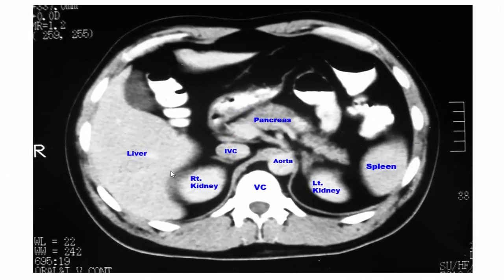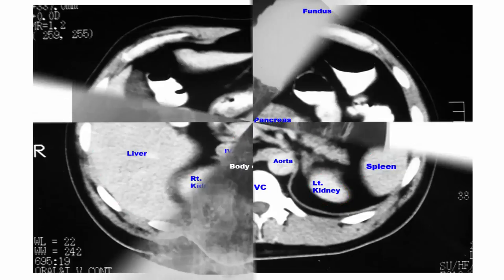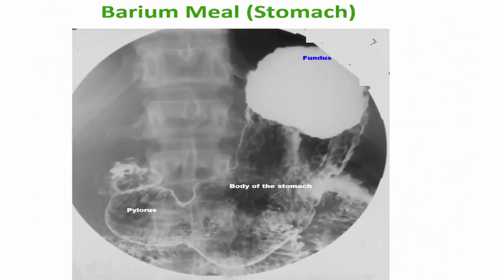Again, this is a CT of the abdomen at a different level, showing the spleen, the left kidney, right kidney, vertebral column, aorta, inferior vena cava, the pancreas, and the liver also occupying the right side.